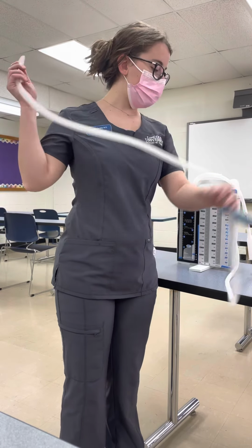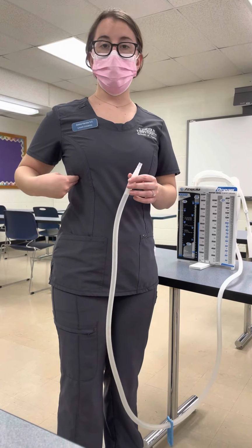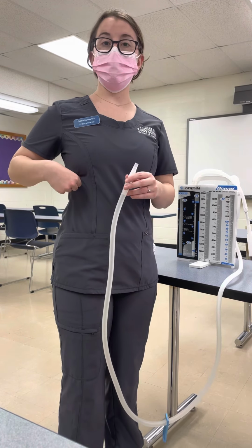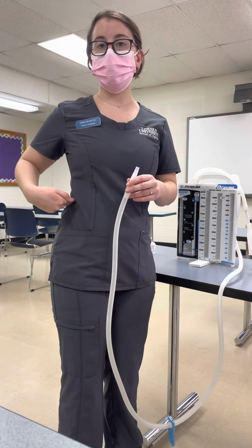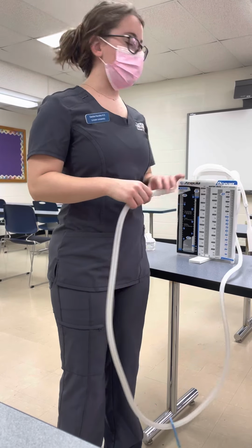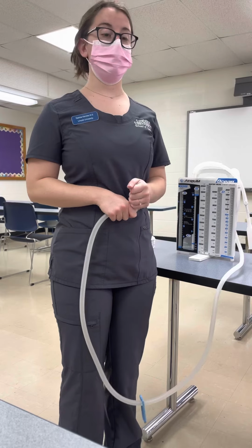And then this tube is one of our tubes that will be for the chest tube. When he inserts it, he'll insert it in the intercostal space of the rib cage here on the side, and the top tube will go towards air drainage, and it'll be near the apex of the lung, and then the bottom drainage will be for any of the liquids such as the blood in this case, and it'll be near the base of the lung on the side. Each of those will be sutured in place and dressed with an airtight dressing over top of them so that there's no air leaks or crepitus that can occur.